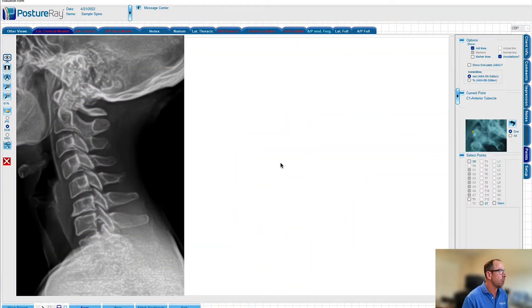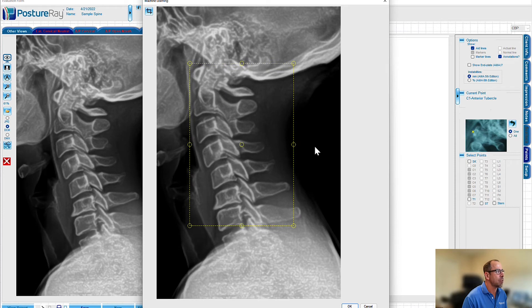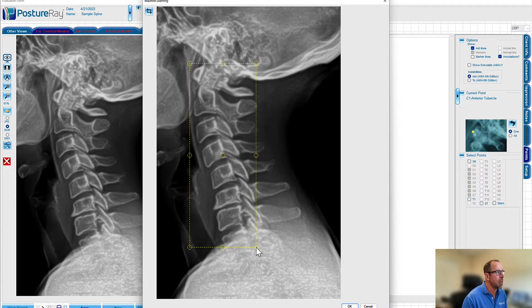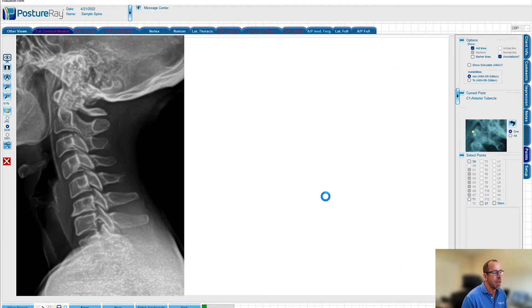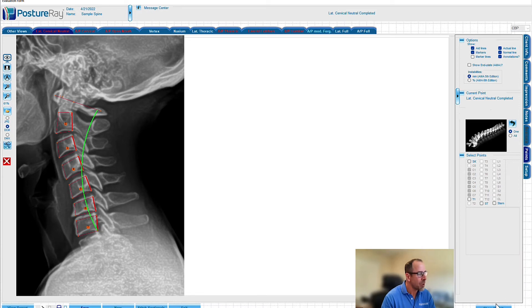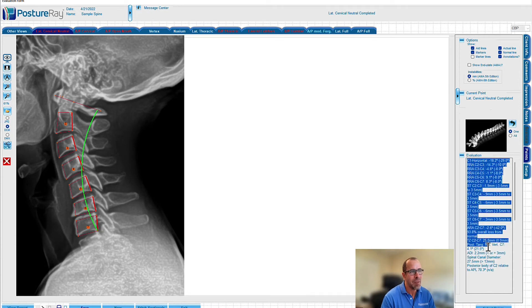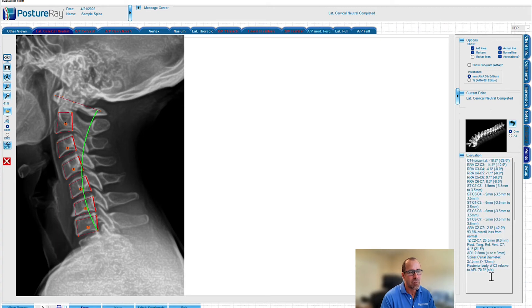Check this out — truly groundbreaking. I've already imported the X-ray here. What your staff is going to have to do on the lateral cervical is come up to C1, come down to the top of T1, and all they have to do is click OK. At that point, the computer is going to analyze the X-ray, and boom — it is done. It has marked the X-ray and measured all the rotations and translations of the cervical spine.